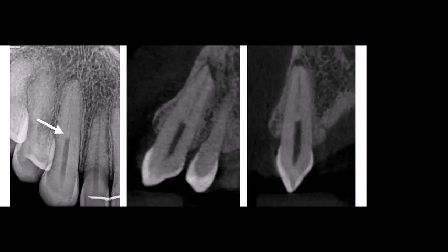So if we have a root canal that is narrow, we will have a lot of contact between the file and the walls of the root canal. So we'll have a high torsional stress. For example, they sent me this case, not because of the curvature, as it's obviously a straight canal. They sent me this case because if you pay attention in the X-ray, you can see that the root canal disappears in the middle of the root.